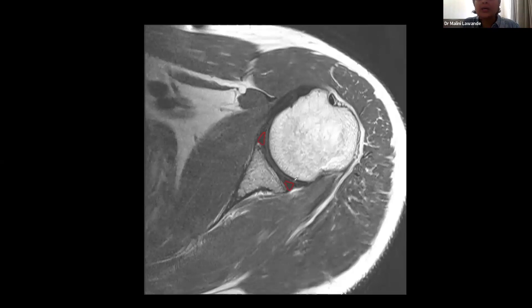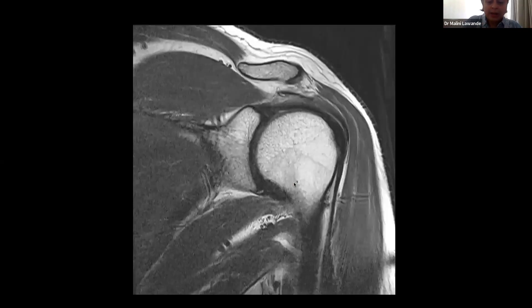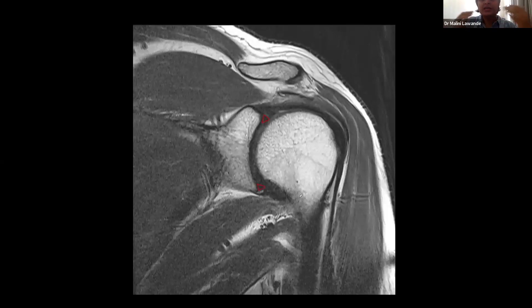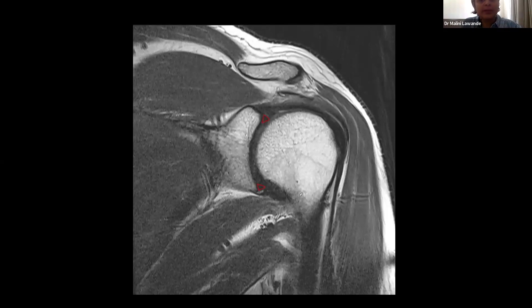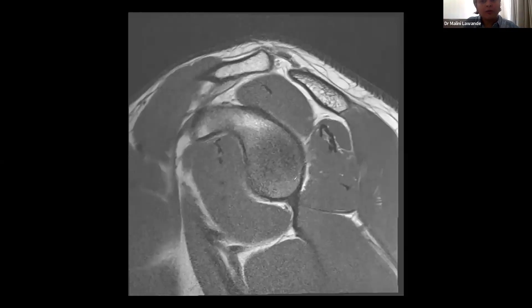We evaluate the anterior and posterior labrum on axial images, while the superior and inferior labrum are evaluated on coronal images. Sagittal images are used to corroborate findings, but not as a primary sequence for labral pathologies, because you may not always capture the entire labrum in one section.